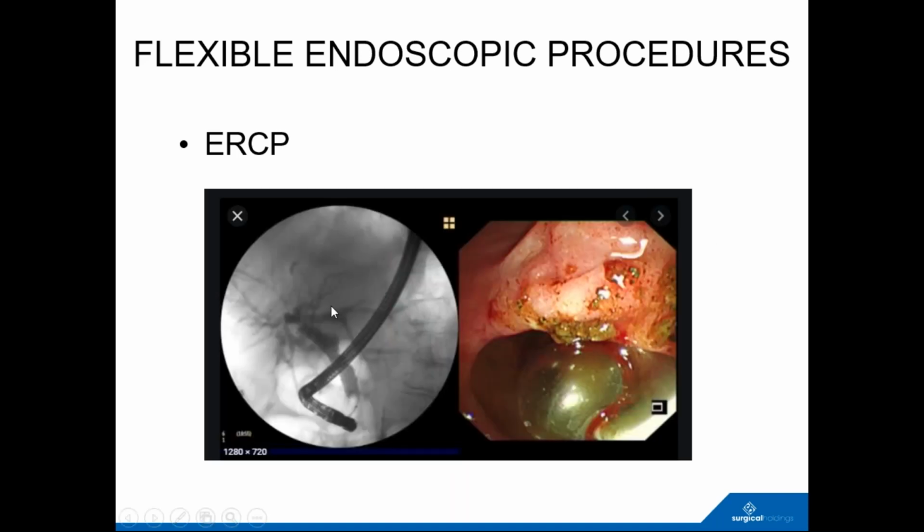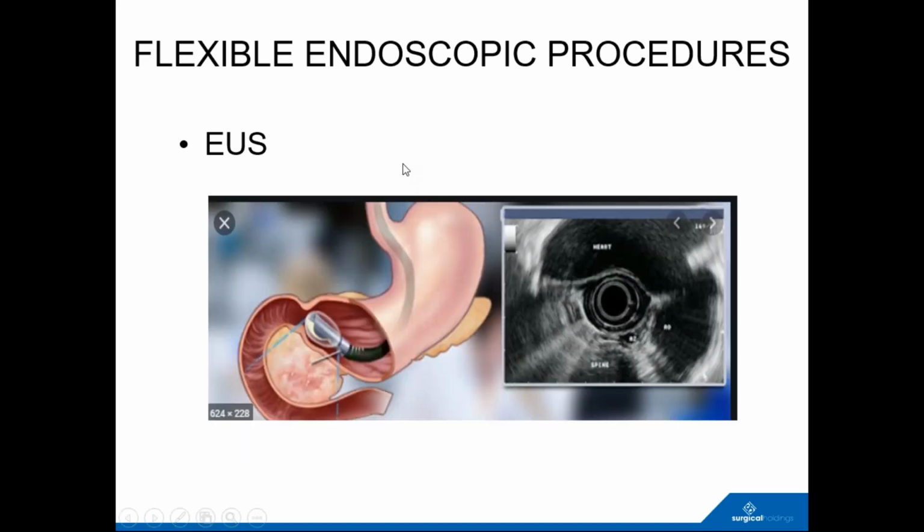that is the fluoroscopic picture. This is the scope, obviously, with side viewing here, and this is the dilated biliary system. This is a gallstone that's gone to the end of the papilla, causing the blockage, and that will then be taken away to deblock it.